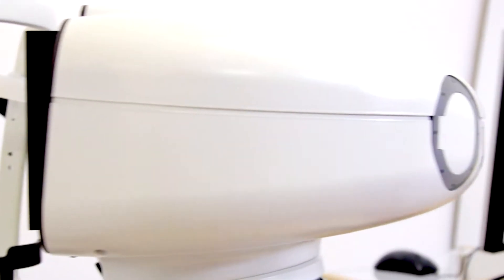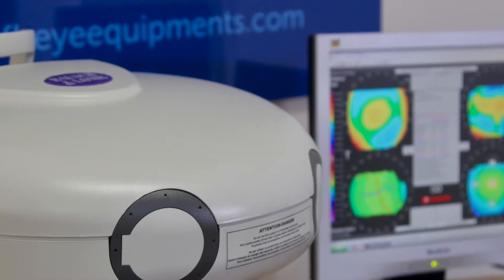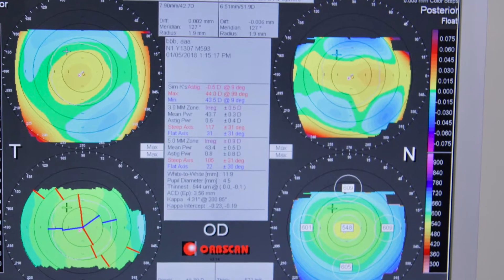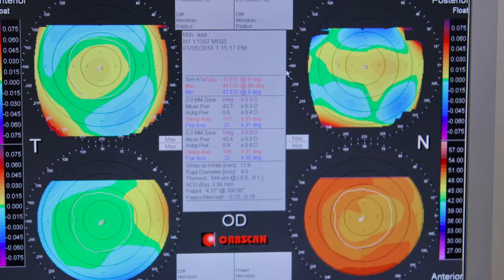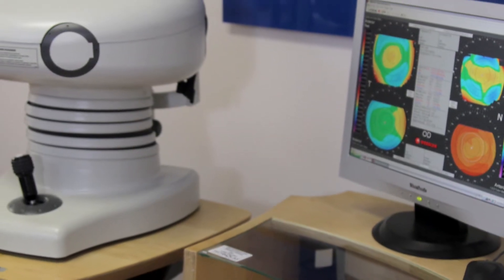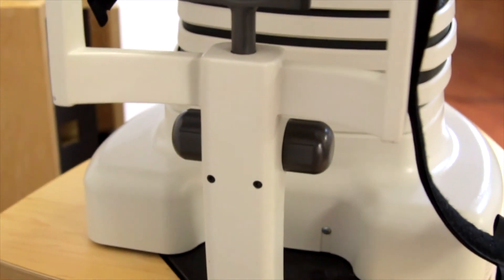It is capable of detecting and analyzing posterior corneal abnormalities where corneal anomalies first appear. Its Windows-based platform is designed to integrate continuing advances via upgradable software, and customizable quad maps show any combination of measurements in one convenient format.